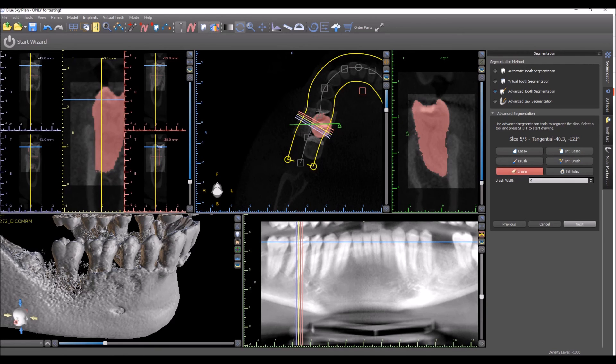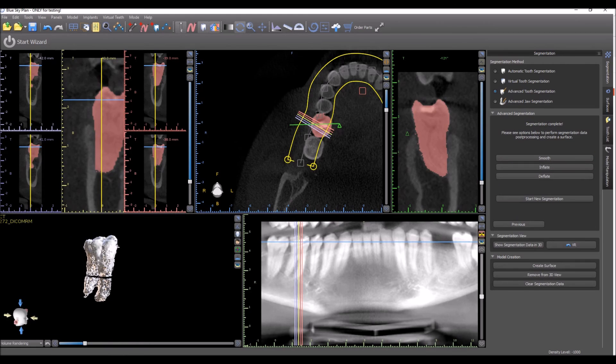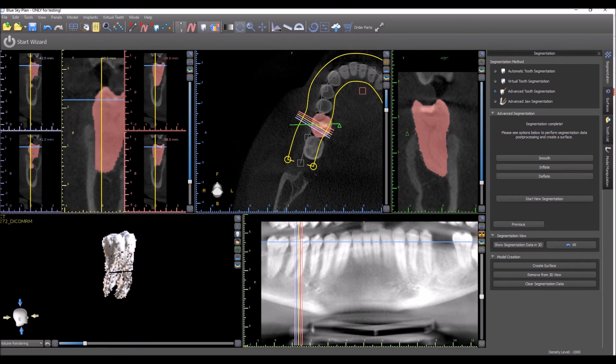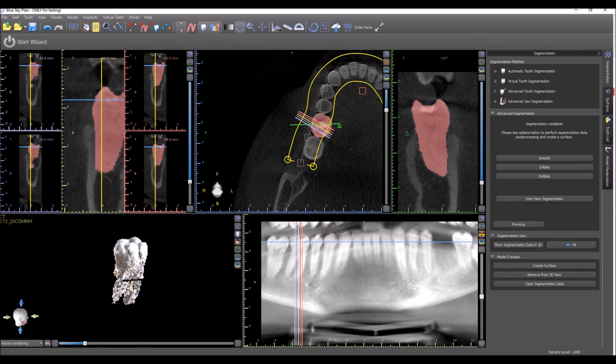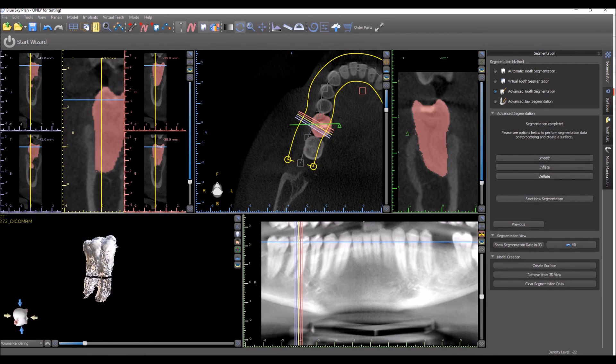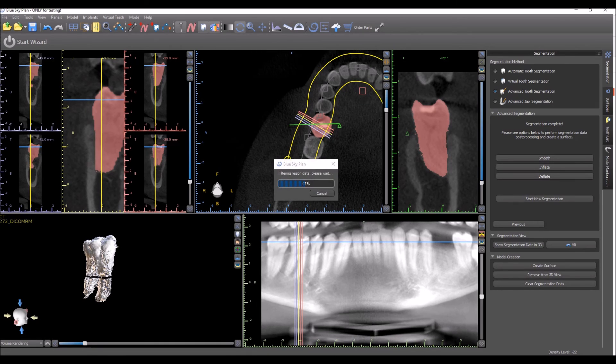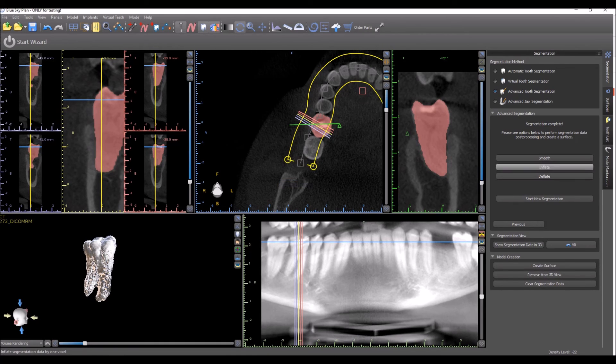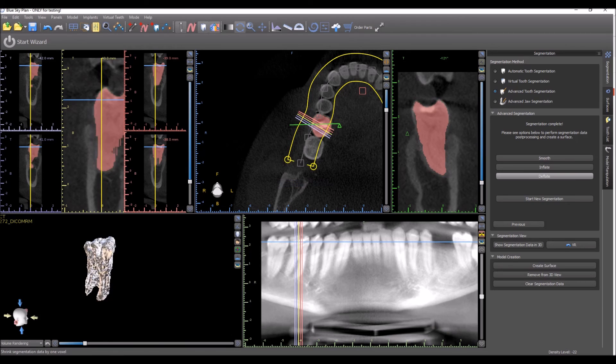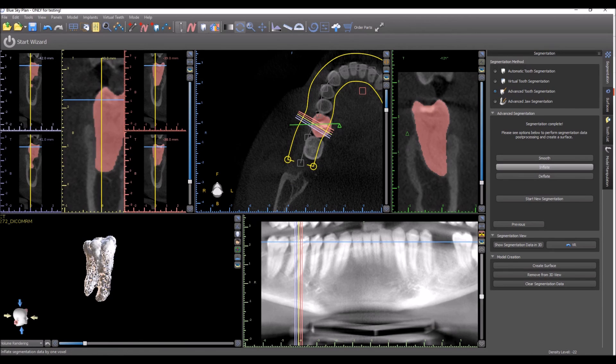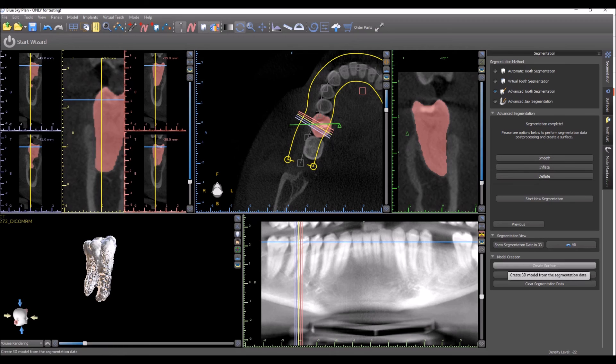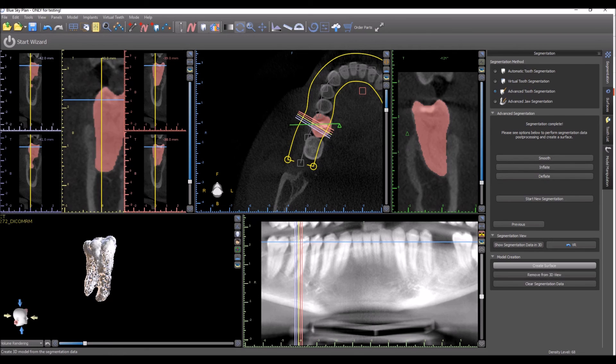As it creates a surface, it shows us the tooth in the 3D view. We have options here to smooth it out, or inflate or deflate it. And once we're done, we press Create Surface.